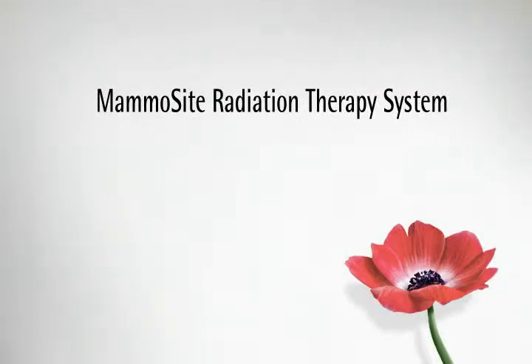Treatment with mammosite is completed in several steps. Here's how it works. Following the decision to proceed with breast conservation therapy, the patient has a surgical procedure called a lumpectomy to remove the cancerous tumor. Radiation therapy is needed to minimize the risk of cancer recurrence.